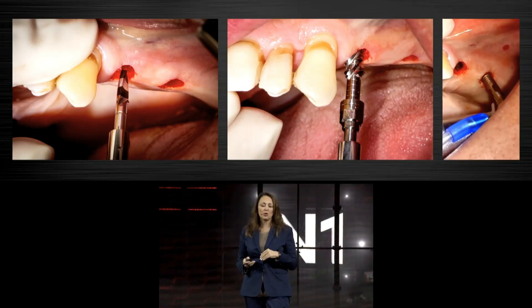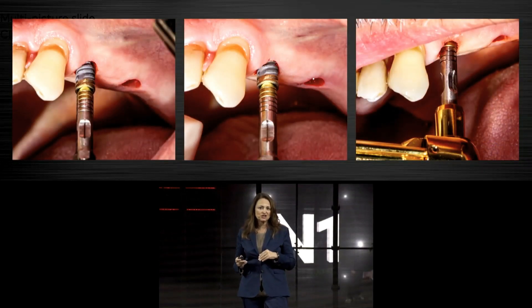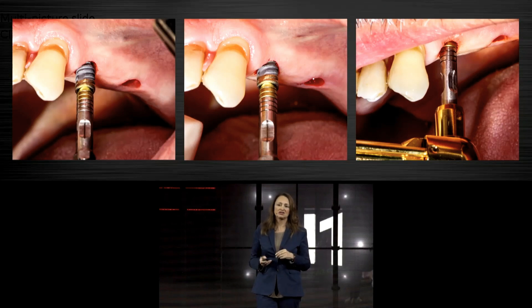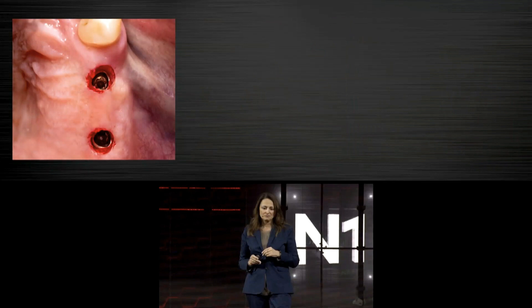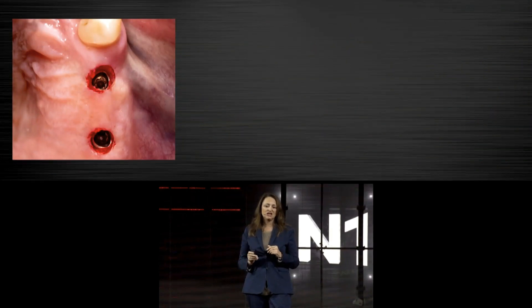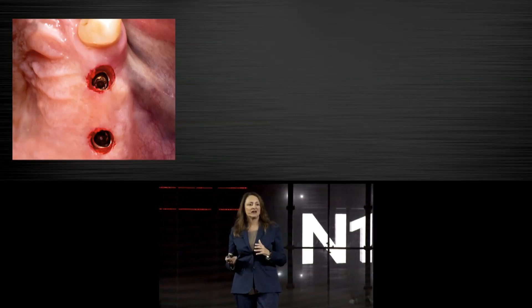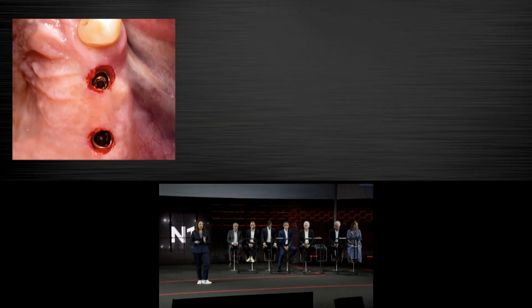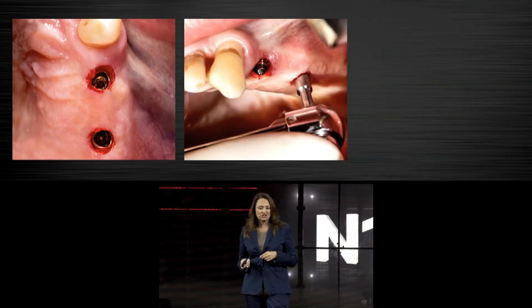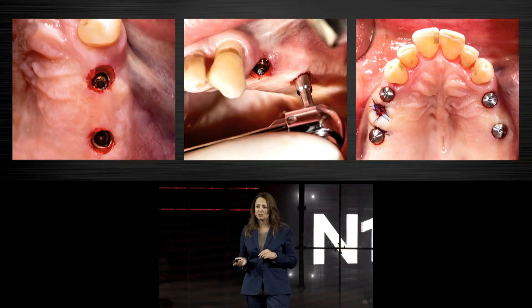You can finalize with the torque wrench, but normally I perform the placement only with machine torque. Here you can see the orientation of the flat side — as we saw in the presentation of Jill and John, the flat part of the tri-oval shape should be oriented to the buccal to give bone and soft tissue more space. We then went for the installation of multi-unit abutments, healing caps, and that was the final result.